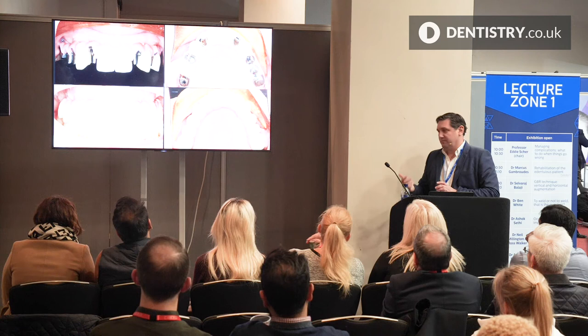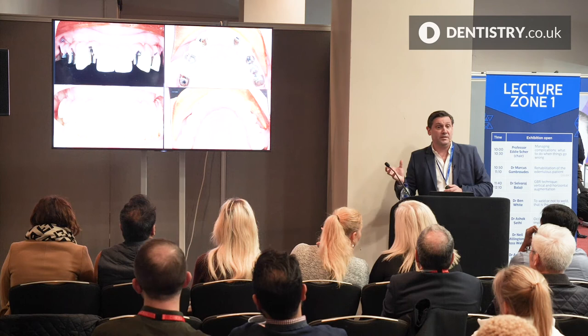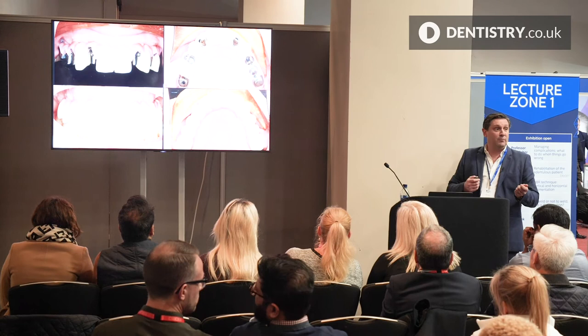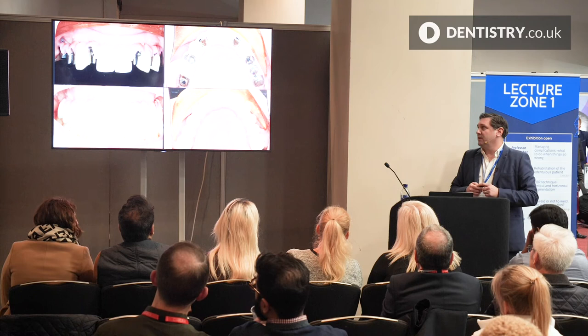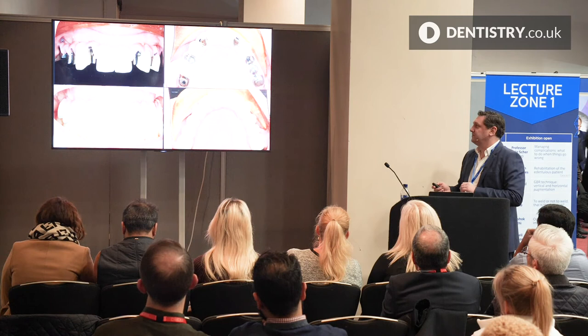If we have a crown come off, we can also take a conventional impression. We can cut the crown off, take a conventional impression, and the technician can just make it like a new crown. Very simple, very easy. We've still got retrievability. So where it's covering the access holes, we just stick it in with a temporary cement. It does allow us to then remove that crown, take the bridge off if we want to, put it back into place again. So it's giving us retrievability, good cosmetic outcome, patient's happy, and I'm happy because I'm not worried they're going to break a bit of porcelain and I'm going to have to remake their bridge for them.